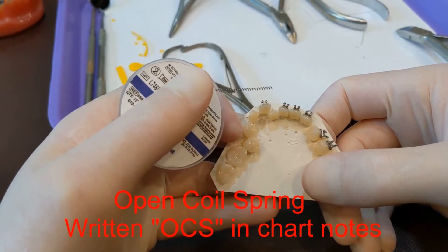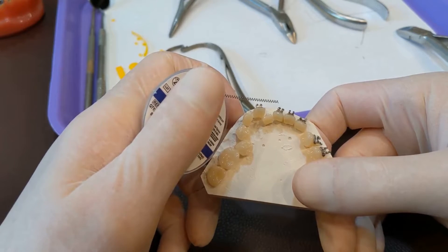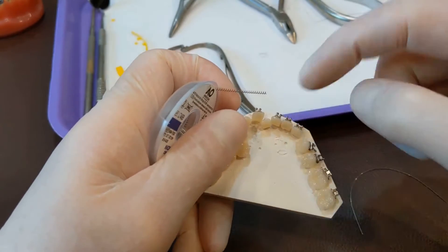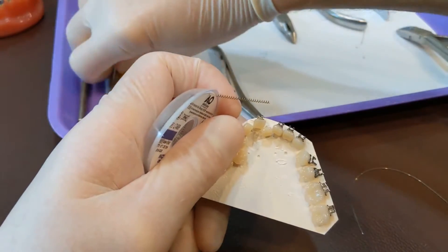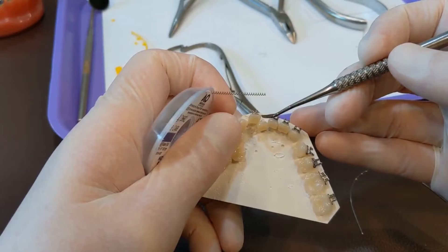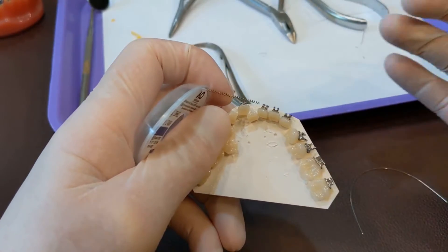I'm going to show you how to place an open coil spring. Open coil spring is meant to open space. For example, where you have teeth with brackets and there's not enough room for a tooth to line up, there's not enough room, so we want to push open space there. That's what this open coil spring is for.